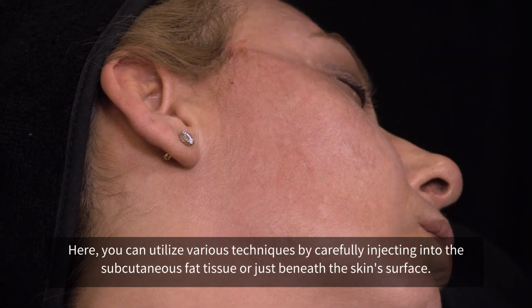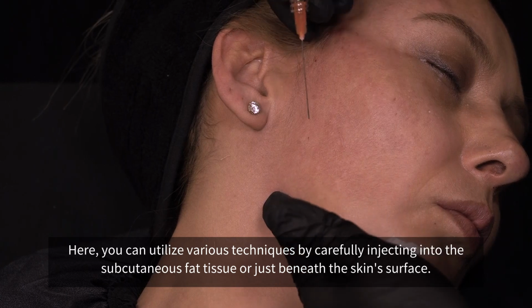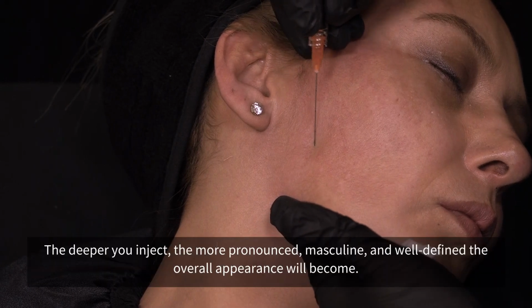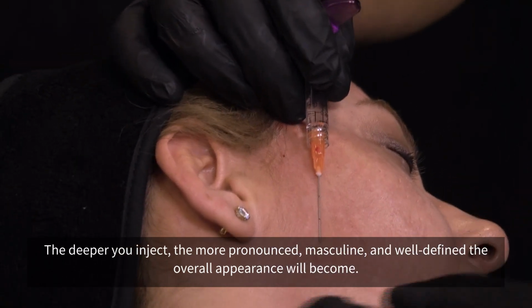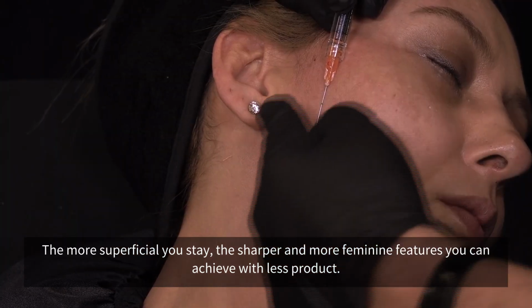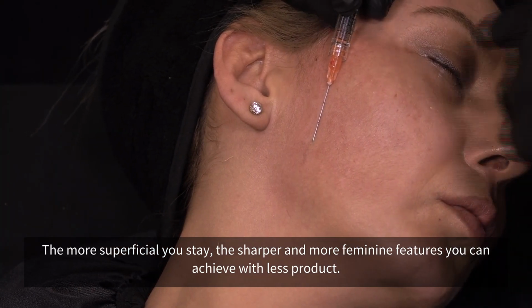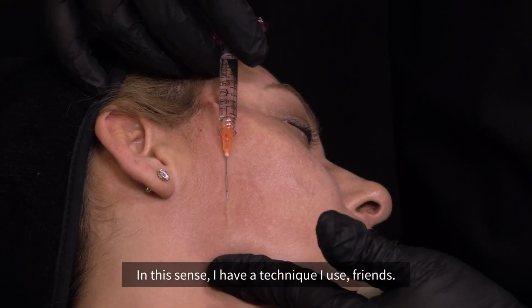Here, you can utilize various techniques by carefully injecting into the subcutaneous fat tissue or just beneath the skin surface. The deeper you inject, the more pronounced, masculine, and well-defined the overall appearance will become. The more superficial you stay, the sharper and more feminine features you can achieve with less product. In this sense, I have a technique I use, friends.